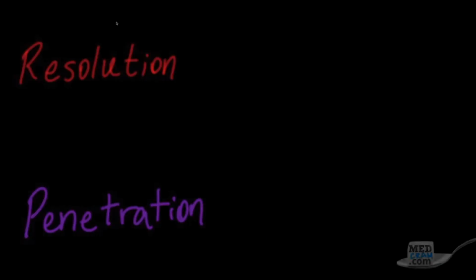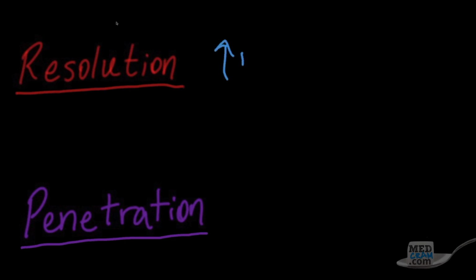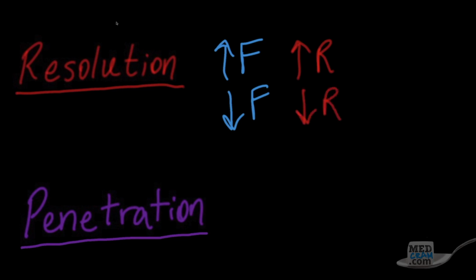So what does this have to do with diagnostic medical ultrasound? Well, it primarily boils down to these concepts of resolution versus penetration. Resolution simply is how pretty your picture is, how defined and detailed the ultrasound image is. Penetration simply is how deep the ultrasound wave is able to penetrate into the patient's body and therefore generate an image. And these things are primarily a function of frequency. As you increase the frequency, you improve the resolution. And as you decrease the frequency, the resolution gets poorer.